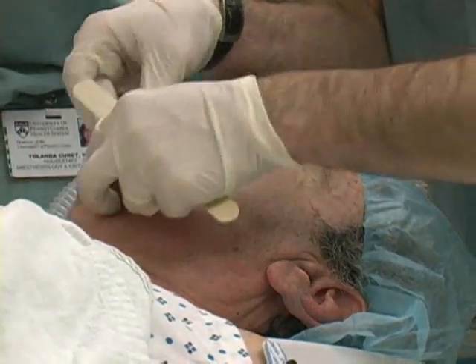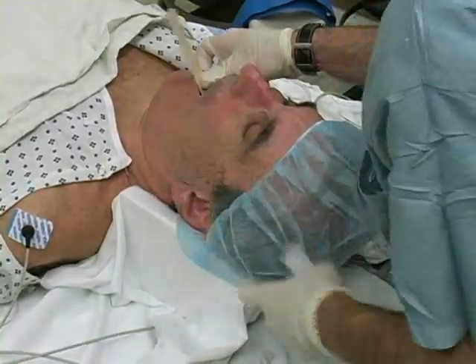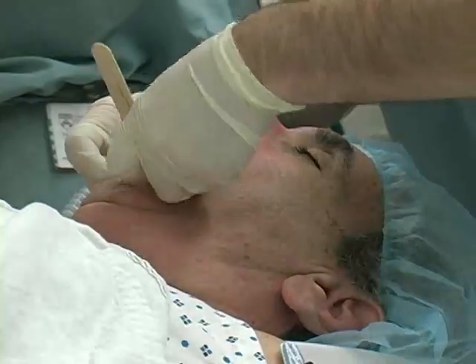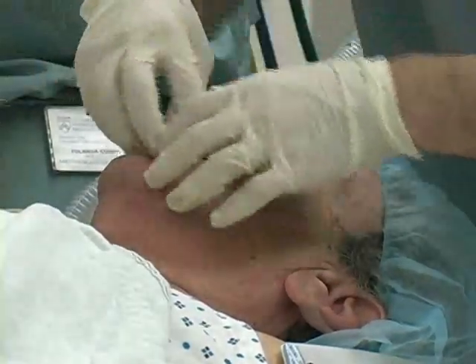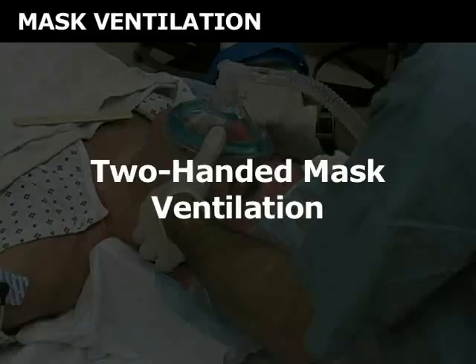Gently scissor open the mouth. Depress the patient's tongue with a wooden tongue blade. Align the curve of the device with the curve of the patient's airway and insert it into the mouth. Gentle pressure upward on the airway will confirm placement behind the tongue.